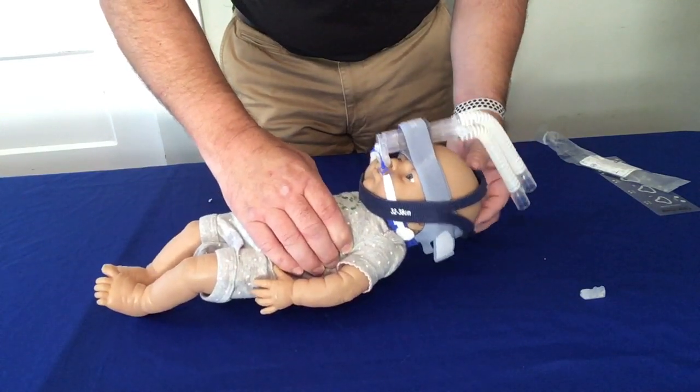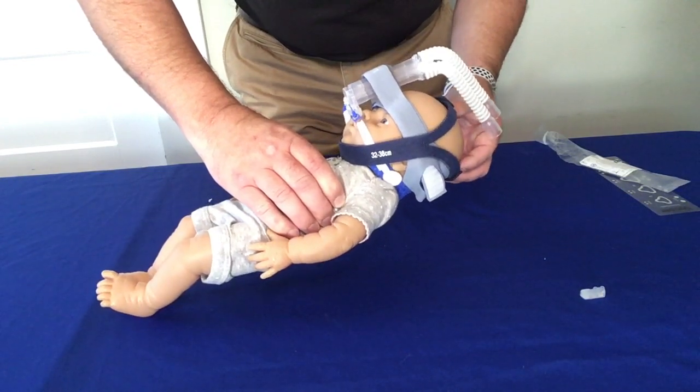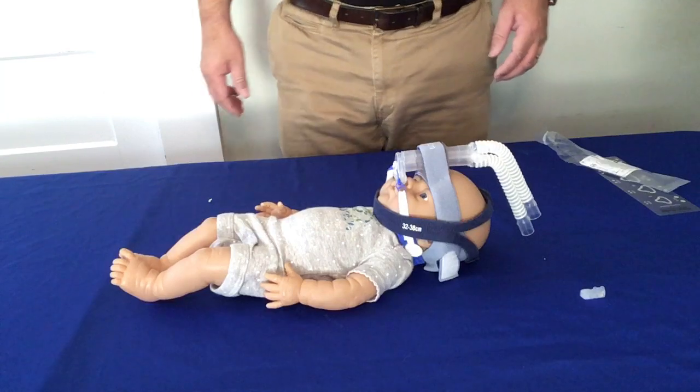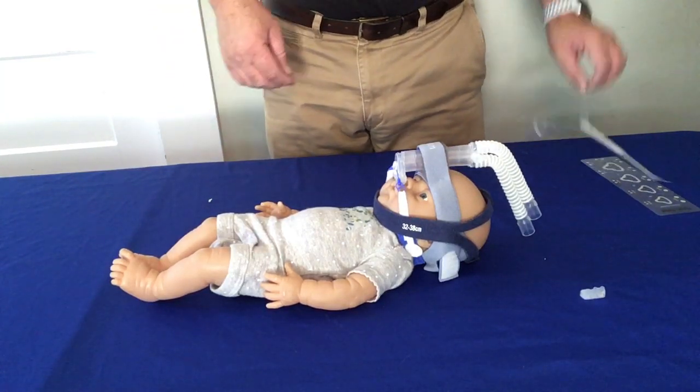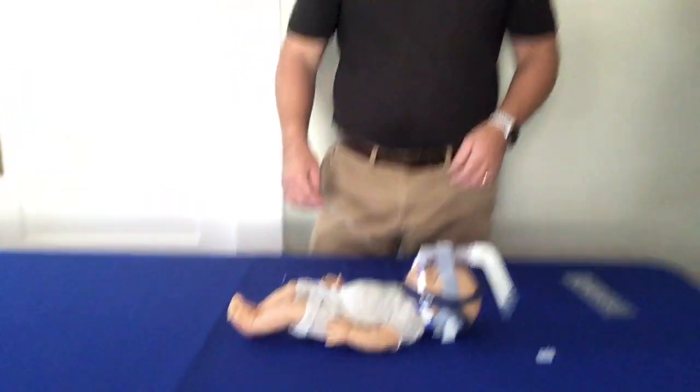And then with this split, go ahead and make sure that the split is on top of the crown of the baby like so, so that it provides the necessary support coming up and doesn't fall off. So that is the use of the chin strap and your headgear, and that'll be it.